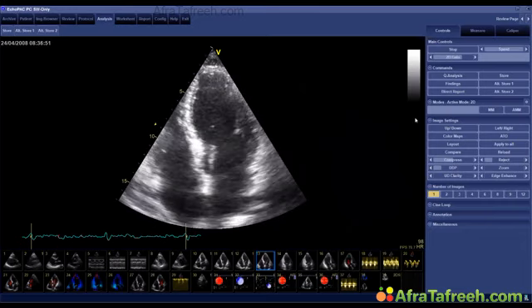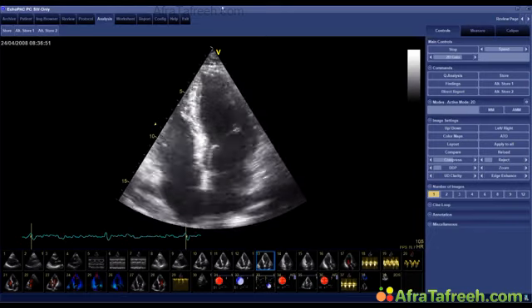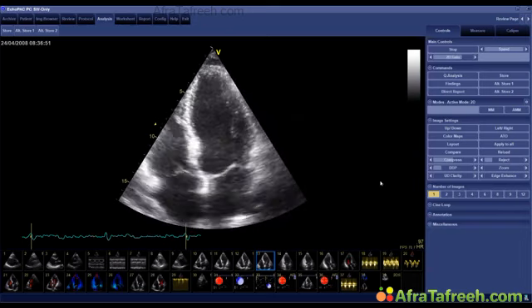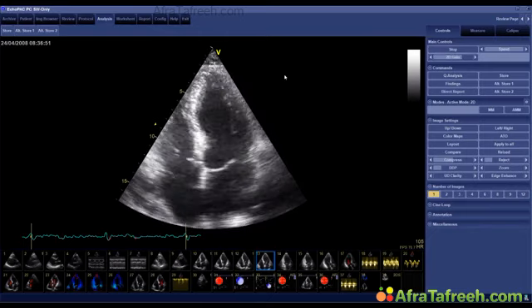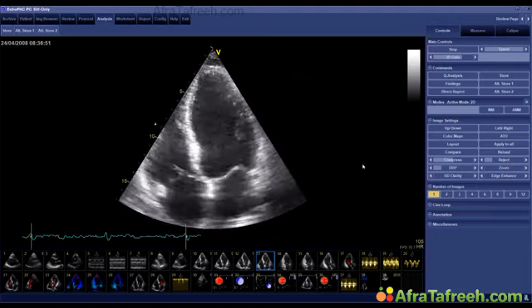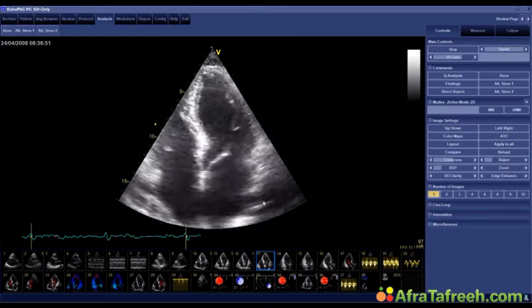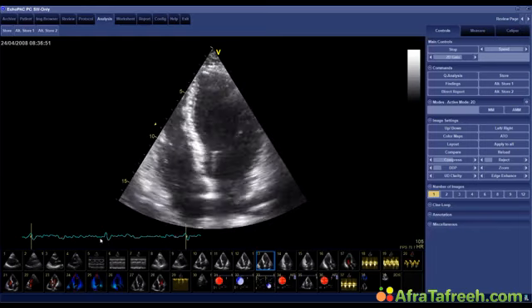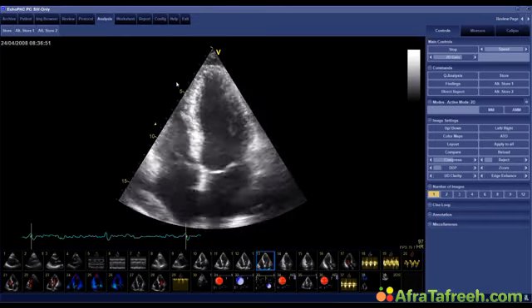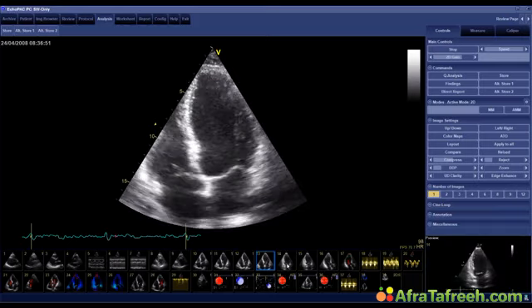Well, if you look at the left ventricle now, you can note that it's actually normal. We have a completely normal contraction pattern, no regional wall motion abnormalities, and when we performed the Simpson ejection fraction calculation, we got something in the range of 65%. But what has happened? Why does the patient all of a sudden have a completely normal left ventricular function? Well, the reason is very simple, because he does not have his left bundle branch block anymore. You can see that here at the ECG. There's a normal QRS complex width. You don't see any dysynchrony anymore. And therefore, left ventricular function is actually better now.